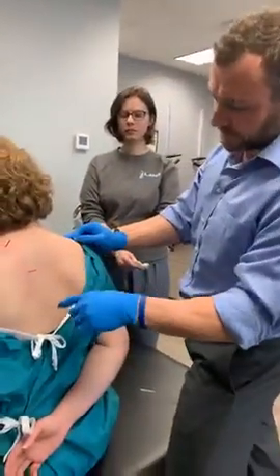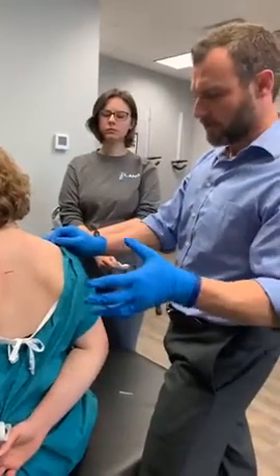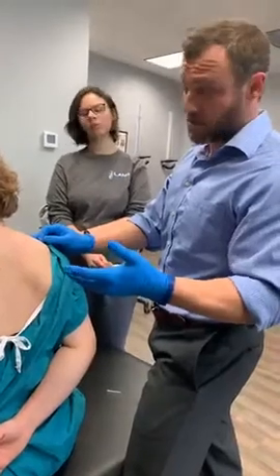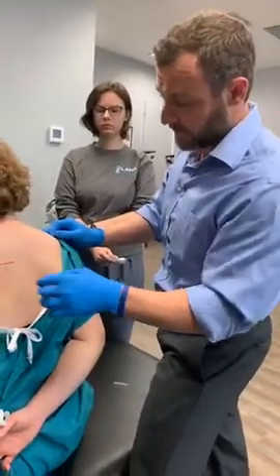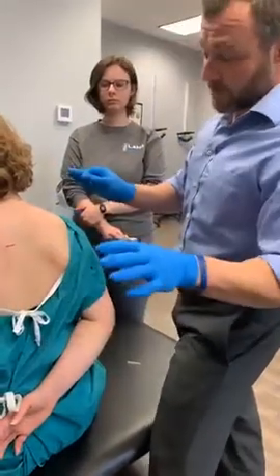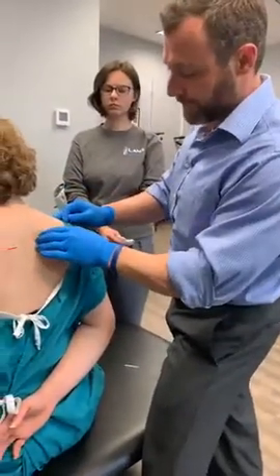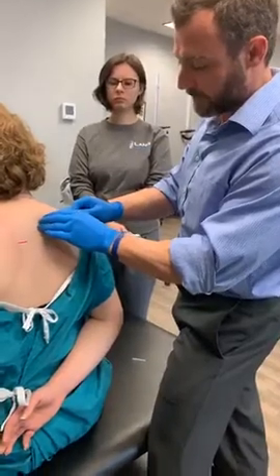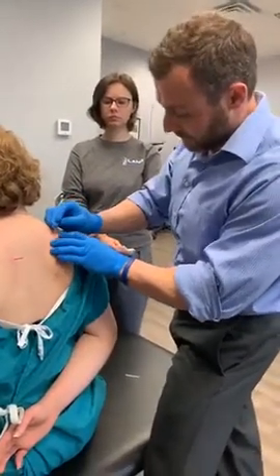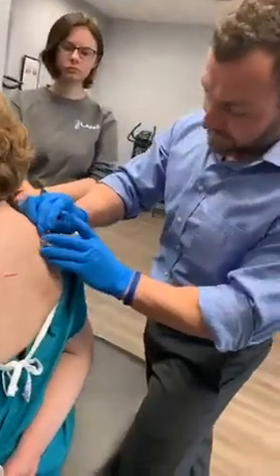And what you'll see as the needles sit, we usually leave these in depending on the criticality of the problem. If it's something that the patient's been dealing with for a long time, we'll leave them sitting for 7 to 10 minutes. Sometimes it evokes a twitch and the knot is gone. We can take the needle out. Other times it takes a little bit more time. We leave them sitting anywhere from 7 to 10 minutes. So right where the levator scap is on this side.